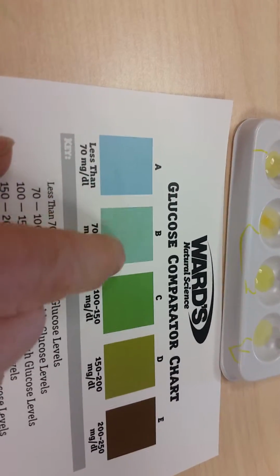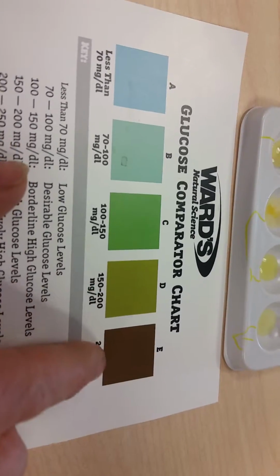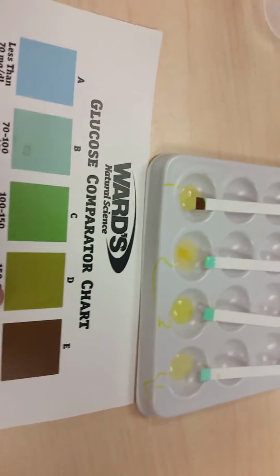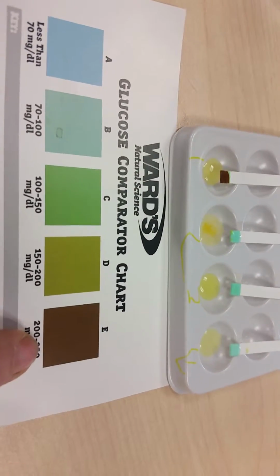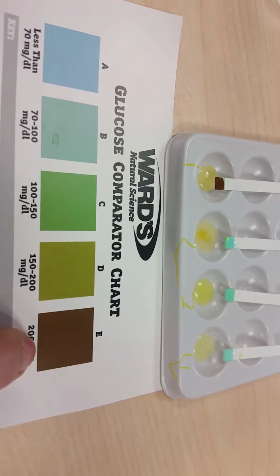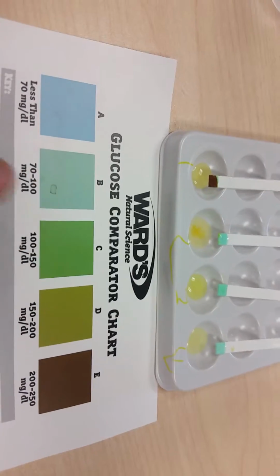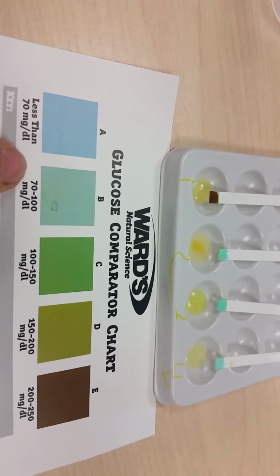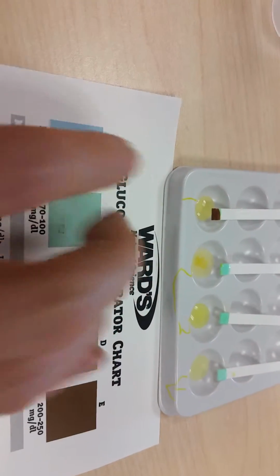But anything in this color range is normal. When you start to get into these colors, you've got high glucose, and that's an indication that there's something wrong. So we can see patient 1 is definitely at the end of the chart. Their strip has turned brown, and they have quite a bit of glucose in their urine, whereas patients 2, 3, and 4 have a normal level of glucose. So they are negative for glucose, patient 1 is positive for glucose.